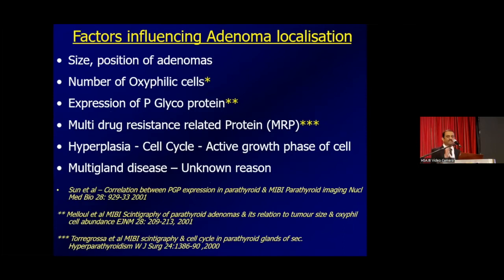So there are many factors which influence the adenoma uptake. Its size and position: the larger the size, possibly the easier it is to be picked up. Position: ectopic positions are difficult to pick up on a planar image. The higher the number of oxyphilic cells, even though the size of the gland or adenoma is small, you are going to have easy uptake of sestamibi and a higher sensitivity.